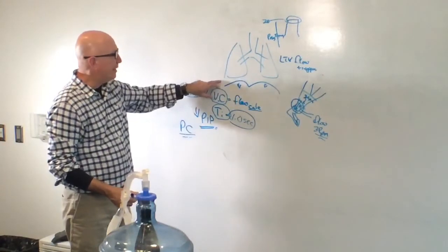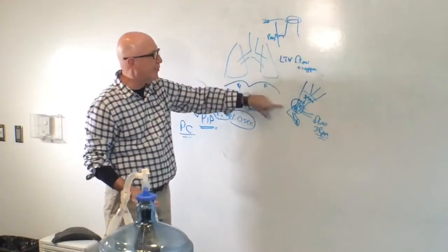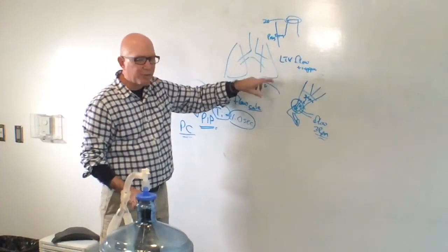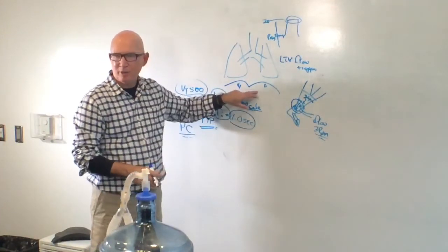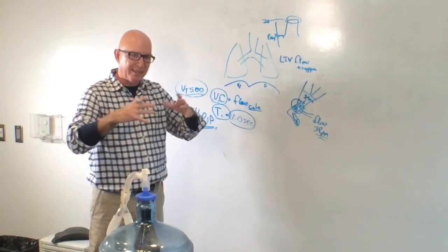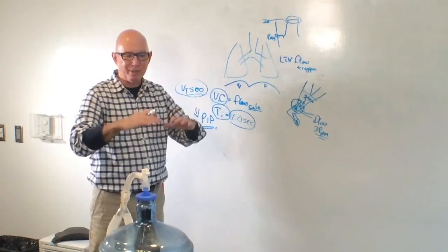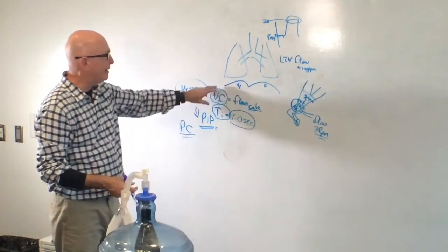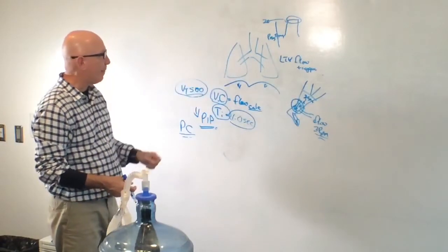Their participation in ventilation depends on how aggressive their inspiration is. So if it's aggressive enough to trigger the flow trigger, then they'll trigger the rate. But even if your patients are not triggering the breath, so you're not seeing patient effort, it doesn't mean that they're not inhaling along with the breath. They still could be inhaling along with it as well, but it could be triggered, as I was saying earlier, by simply, as the lungs expand and they start to push the diaphragm down, then there's a secondary trigger of the respiratory muscles of the diaphragm, which affects it as well. So in that case, they're not participating a lot in ventilation, but they are inhaling along with the ventilator as well.